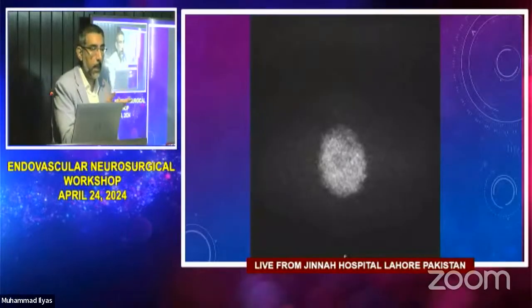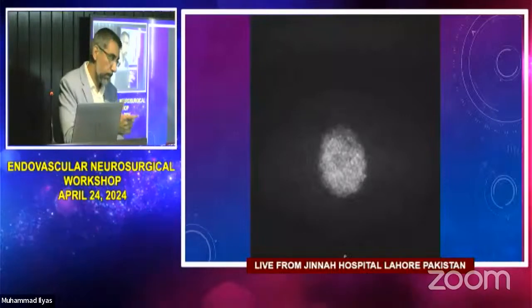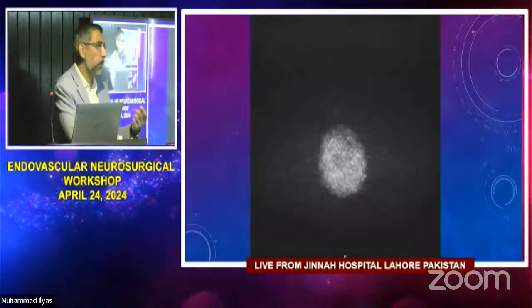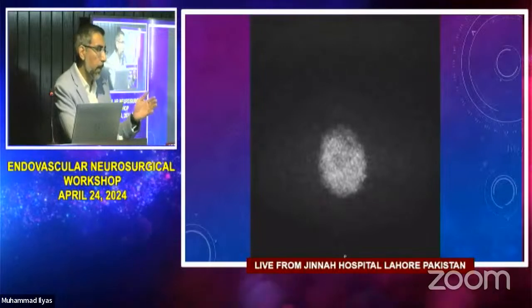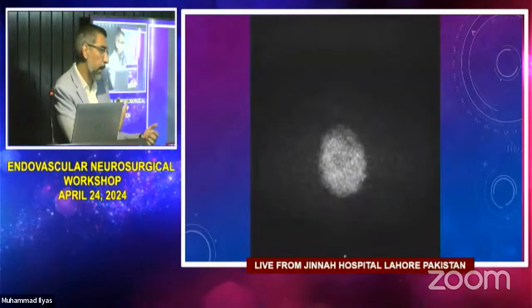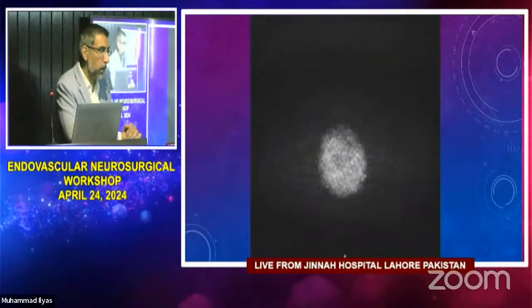For this procedure specifically, we put heparin in our flushes. The bolus to the patient is 3,000, and then we put an additional 3,000 to 4,000 units of heparin in our flushes. The flush runs very slowly, about 1 ml per minute or something like that. We just need to keep it dripping. If you stop the flush, the blood will back up into the catheter and clot off, and next time you run a wire through it, the clot's going to go into the brain. So you want to keep the catheter on the flush all the time.